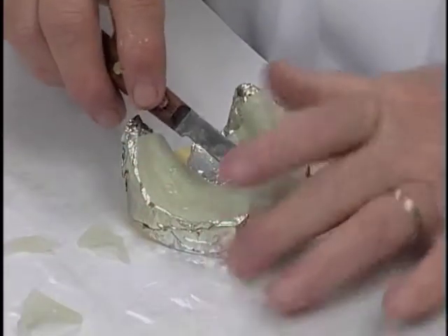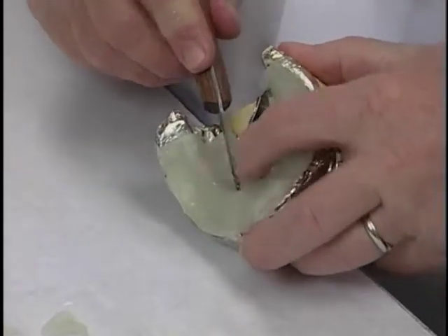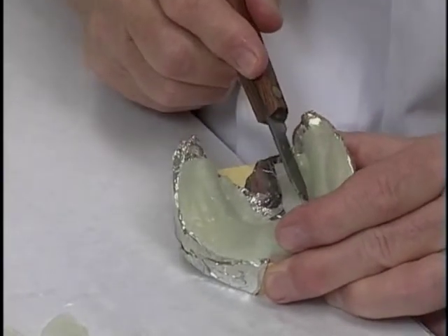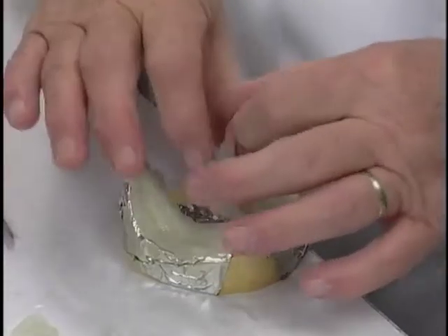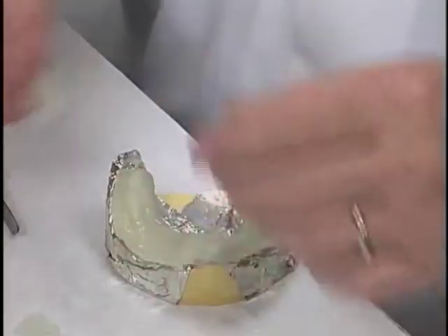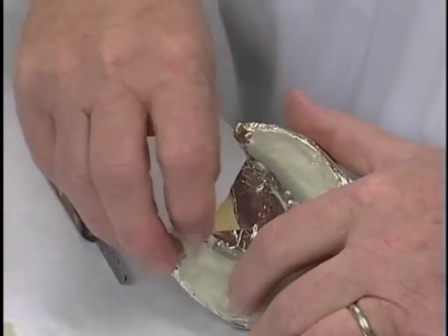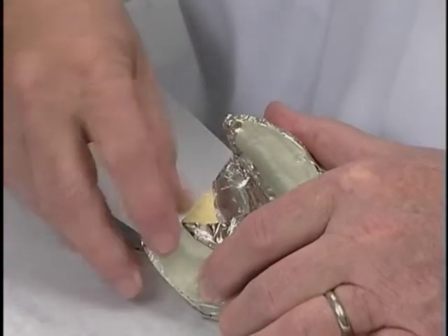Cut the excess from the lingual. We can utilize some extra material that we might have left over and adapt it into the void areas, such as we have here on the lingual.